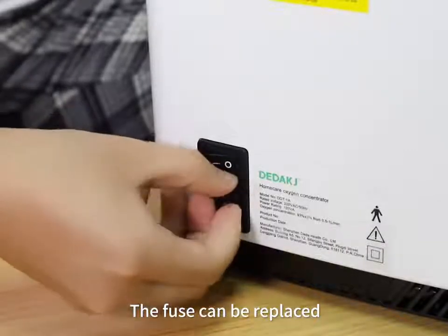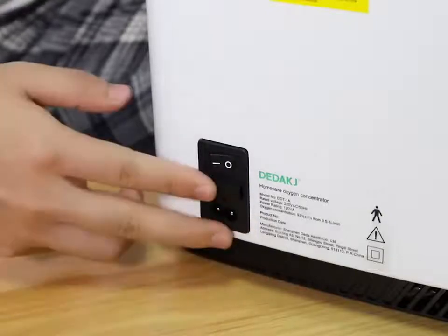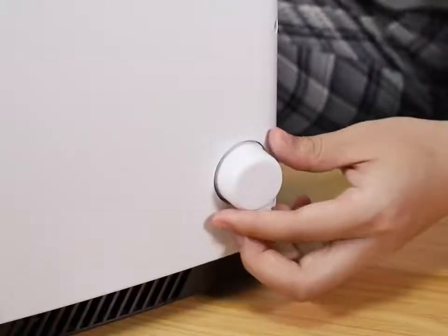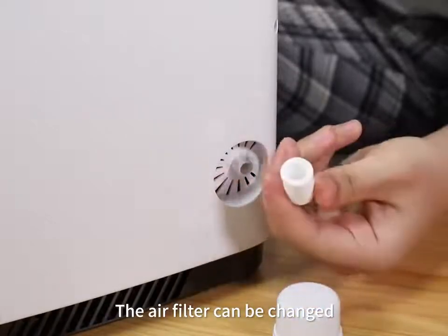The fuse can be replaced. The air filter can be changed.